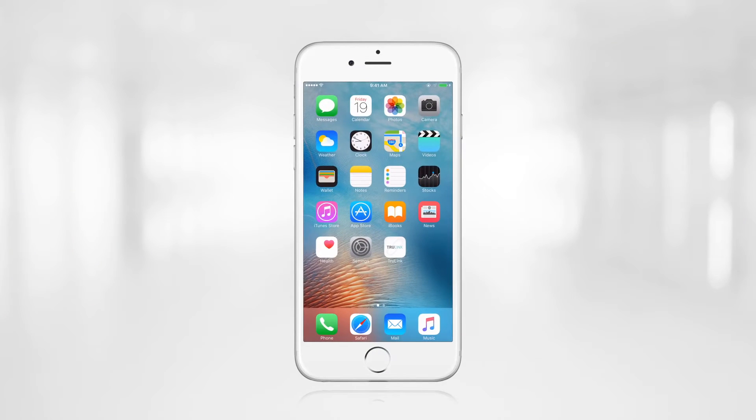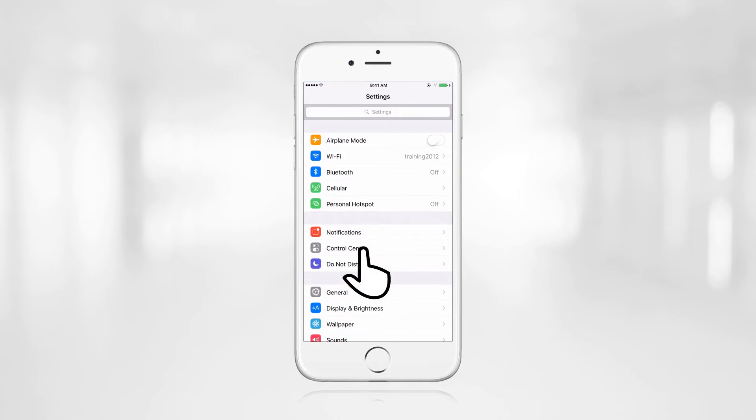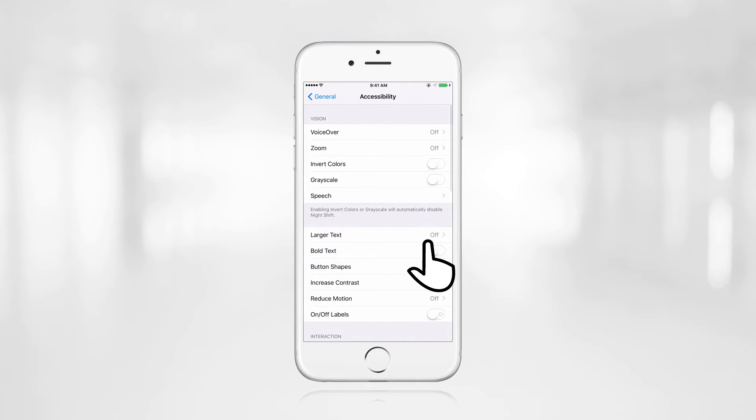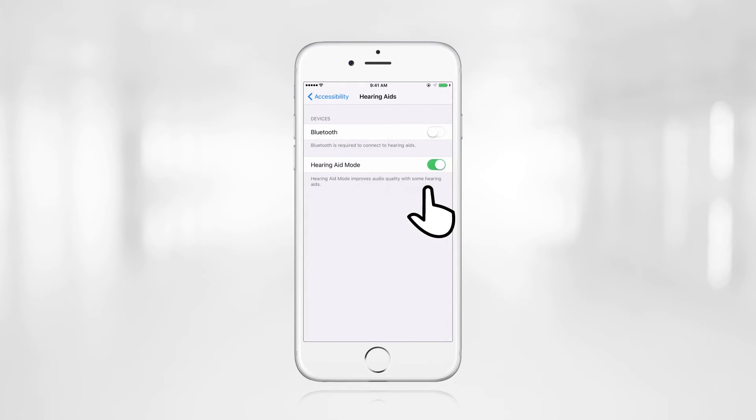To pair the Halo hearing aids to the patient's iPhone, click on the Settings app. Then find and click on the General tab. From here, select the Accessibility menu. Scroll down and select Hearing Aids. If Bluetooth is not turned on, turn it on from this screen.